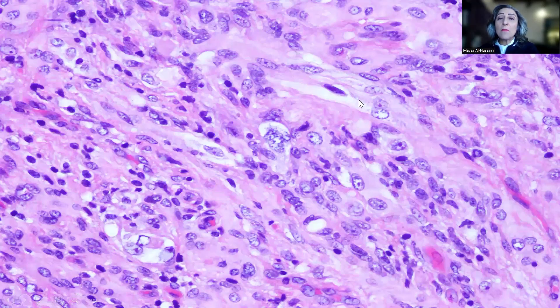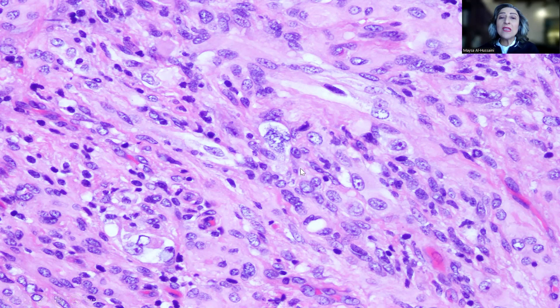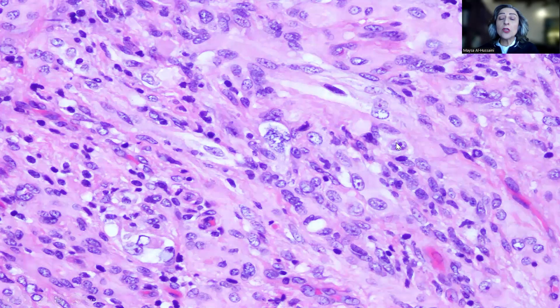This is a higher-power magnification where we start to see more details of the constituting cells. As you can see, the cells show some degree of pleomorphism. We have some atypical pleomorphic nuclei, other cells showing prominent nuclei, while other tumor cells are small, and they have a tendency for spindling.